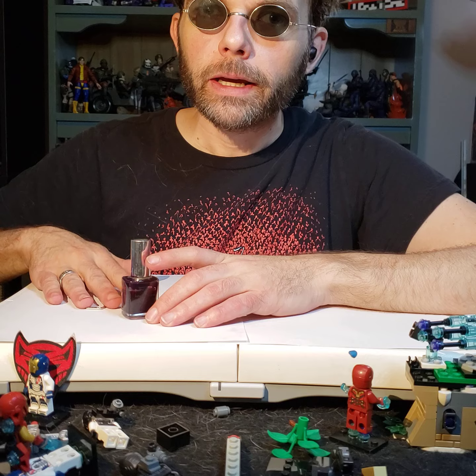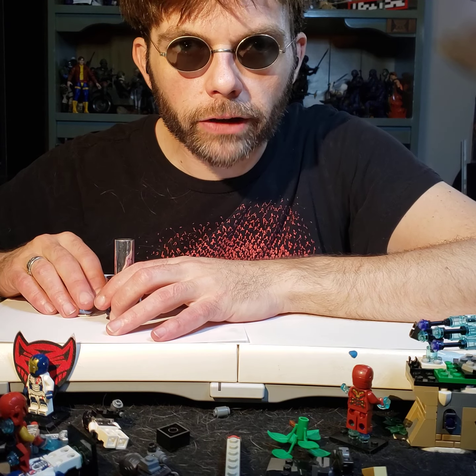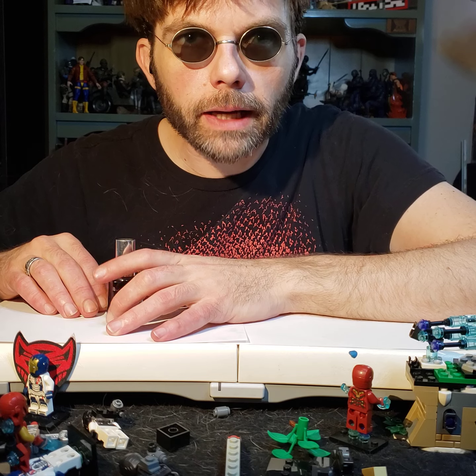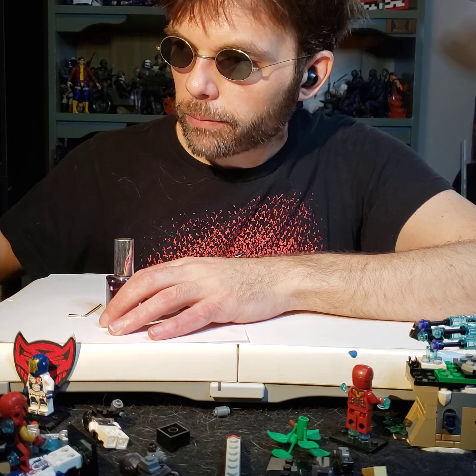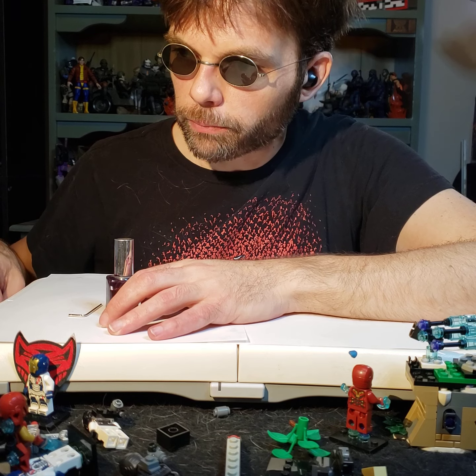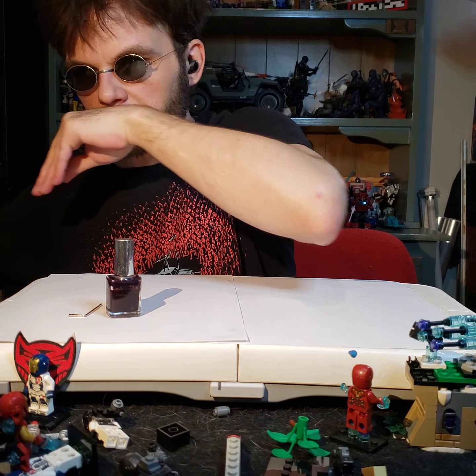Today we're going to be teaching you how to repair your carbon fiber collapsing cane. Now, sometimes the cane is irreparable. Sometimes you'll actually crack it, and that's not good. That's no bueno if you crack it. But if you just have some simple wear and tear, you can actually fix it pretty easily and effectively.